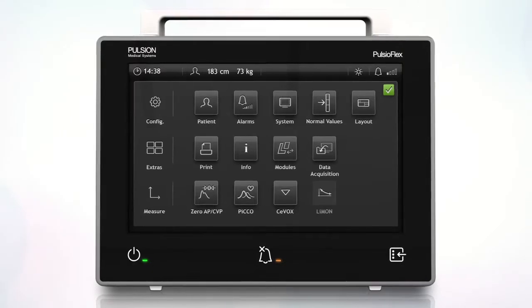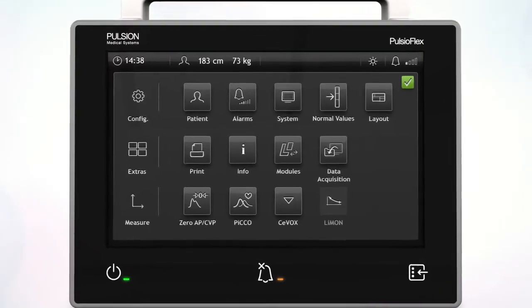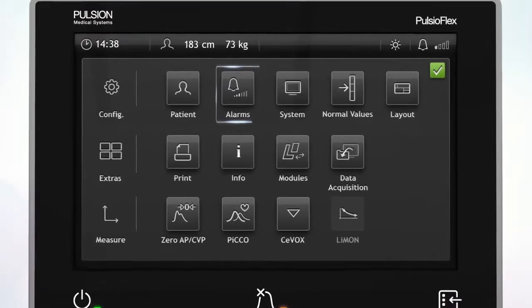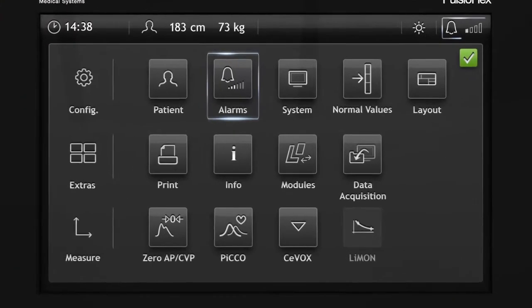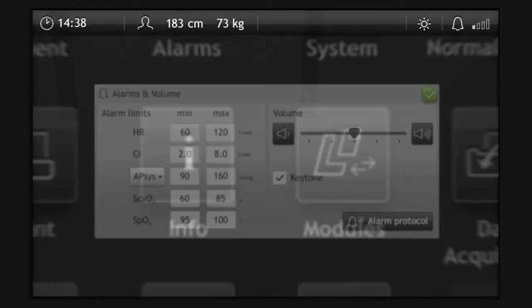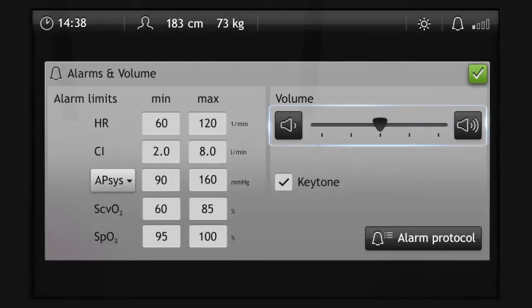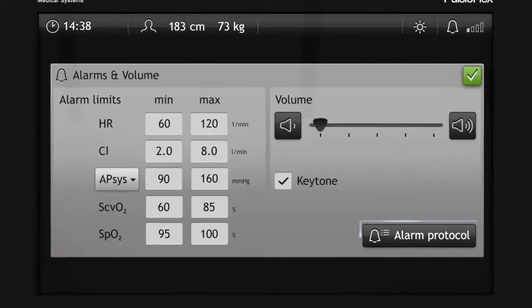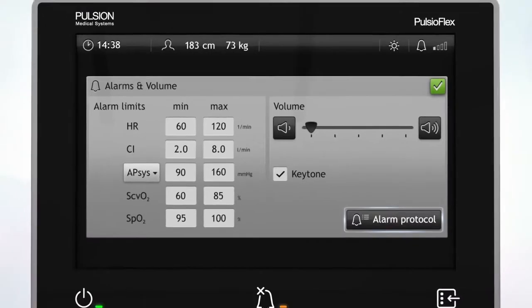The alarm and volume settings can be activated via the main menu or the status line. The alarm volume can be muted and the alarm protocol can be displayed.